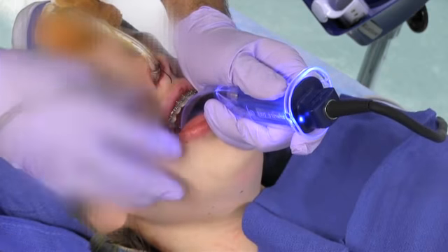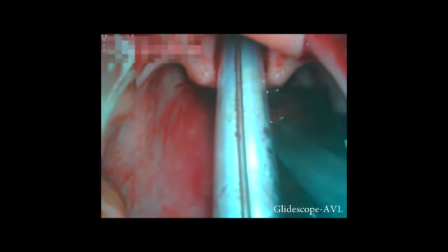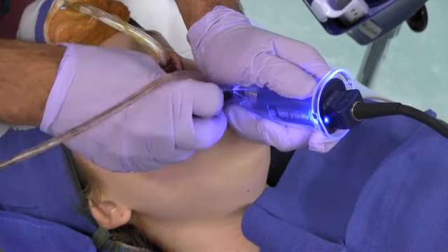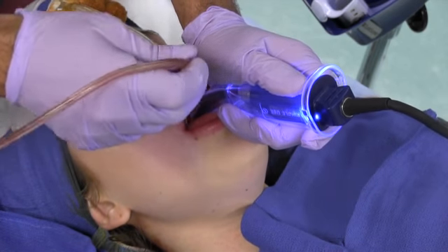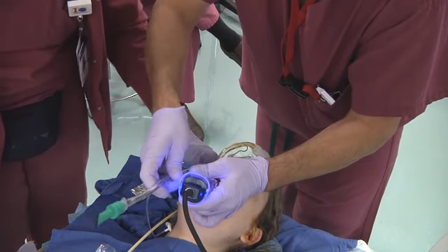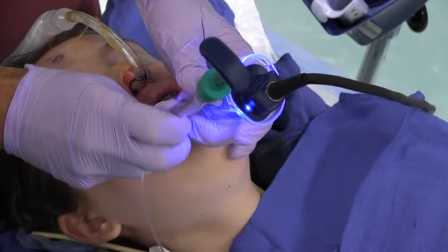Because the airway will be unprotected for a short period of time, a nasogastric tube will be passed in order to empty the stomach. The nasogastric tube has been removed in order to allow more space in the hypopharynx for manipulation. A styleted tracheal tube is placed in front of the larynx.